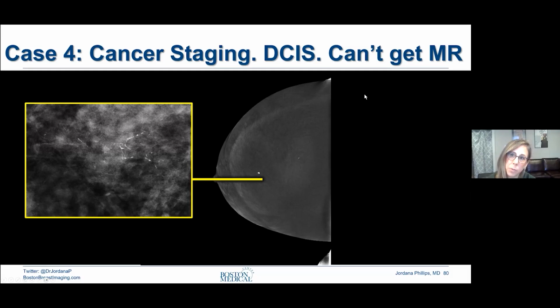This is an example, and the reason why I'm including it, still of a positive contrast mammo because it's showing those calcifications, even though there's no enhancement here. This is one of the challenges of contrast mammo for calcifications, where some DCIS and low-grade invasive ductal cancers might not show enhancement. We have to act on it anyway. So when thinking about cancer staging for calcifications, we don't actually use the recombined images to help us determine whether to do something about the calcifications. It's really to see, is there enhancement separate or beyond the area of calcifications that might impact the overall treatment plan.